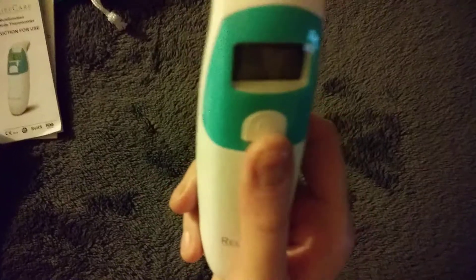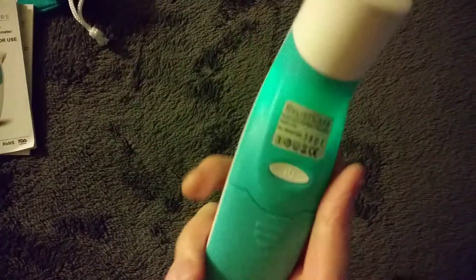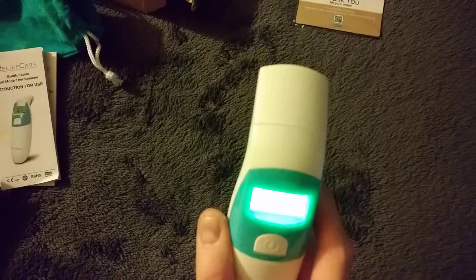Now there are two ways of taking your temperature. The first way is by forehead. All you have to do is hit the power button on the back. You'll hear a beep, it lights up in green, and then you'll see the three little dashes appear. Then you take the thermometer and place it on your forehead for the measurement.